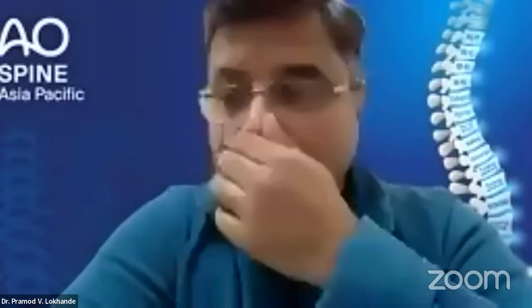Yeah, it's very individual. I think it's first of all how naturally gifted you are, that matters a lot. Second is how focused you are, how adamant you are in using this particular technique. So you need to have a lot of experience using the interlaminar technique before. So you have to start with the L5-S1 level. You have to learn how to handle the instruments. Controlling the endoscope, like you said, is the challenge with the interlaminar technique. So you need to control it.